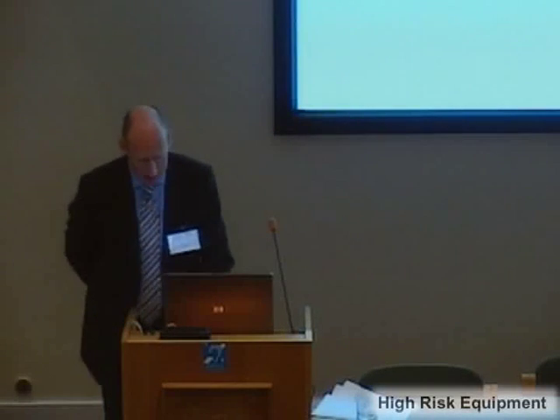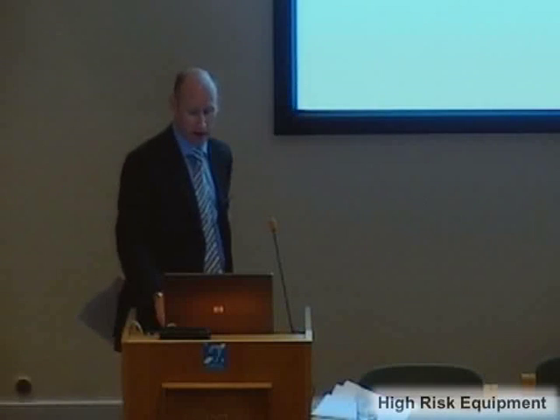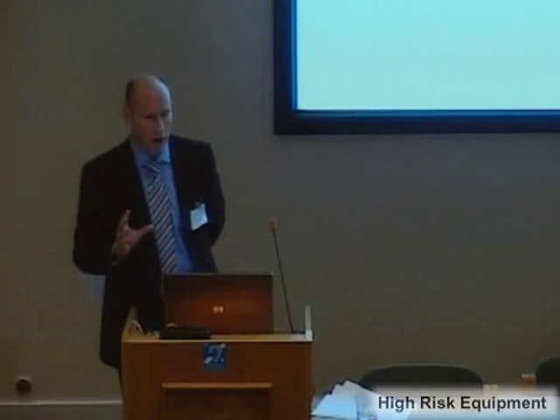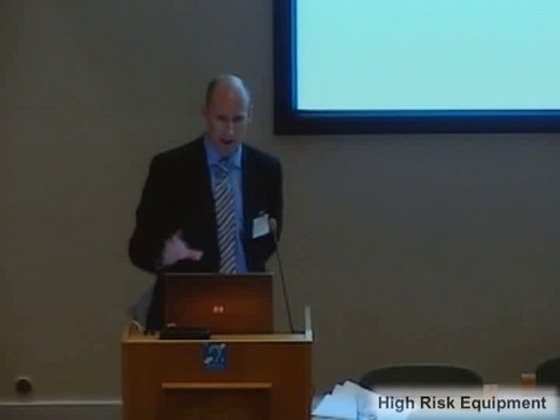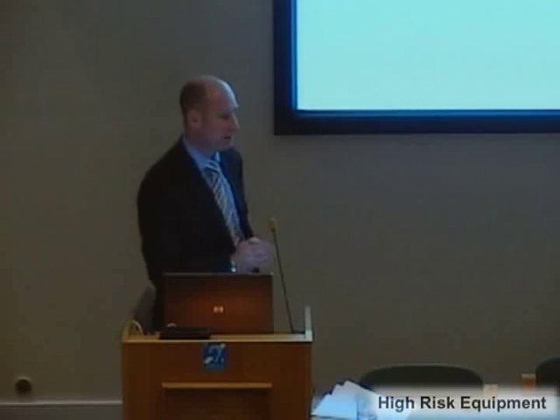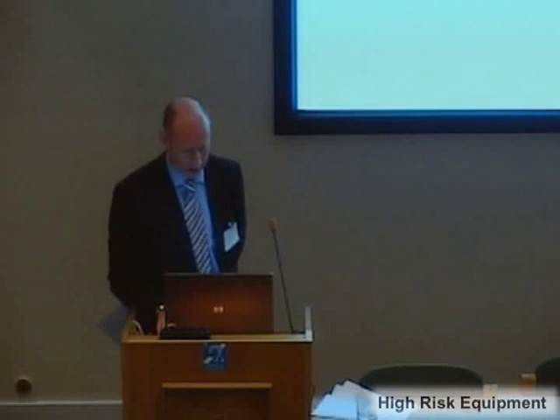So there's lots to think about on positioning this high-risk equipment, certainly an MRI scanner, and I would always recommend that if you've got the brief from the customer saying we want an MRI in our radiology department, you start with that. You forget fluoroscopy, forget CT, MRI needs to be in position first. It's highly important to get that in the right position.